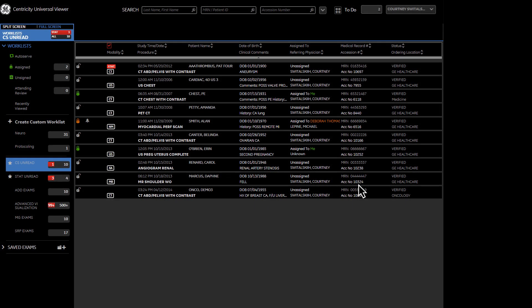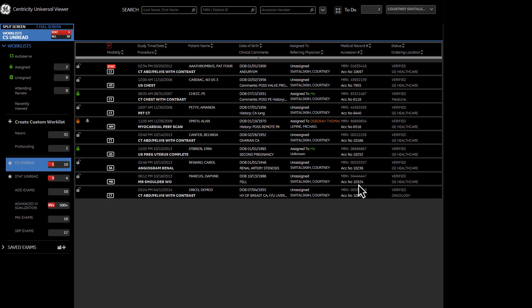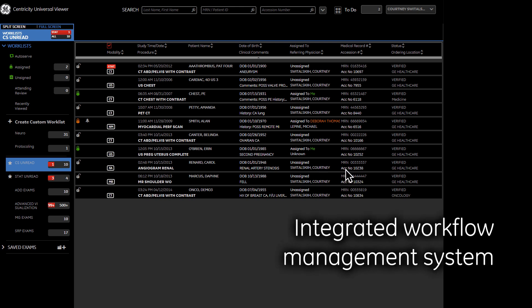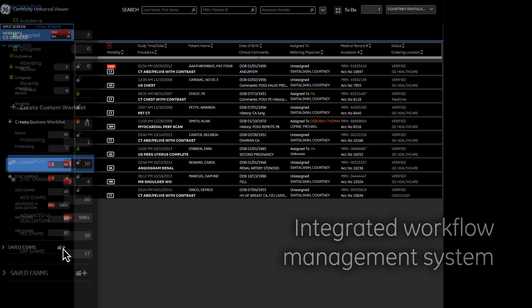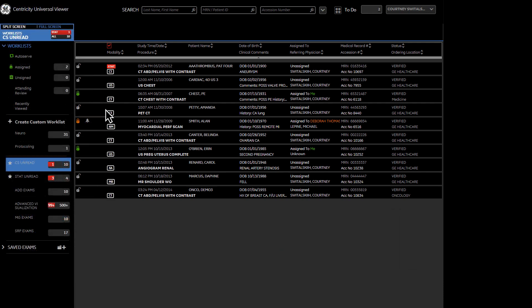Universal Viewer's Intuitive Workflow Manager uses a unique, intelligent worklist with AutoServe to provide smart allocation and workload balancing, including redirecting exams for greater productivity. Stat exams are automatically routed to the top of worklists, ensuring prioritization.